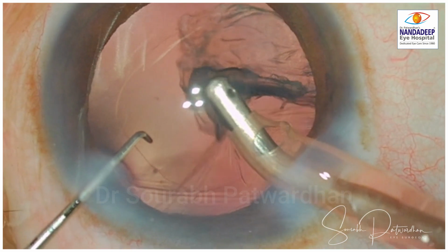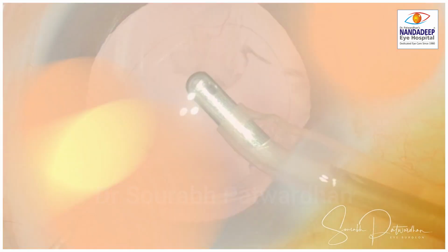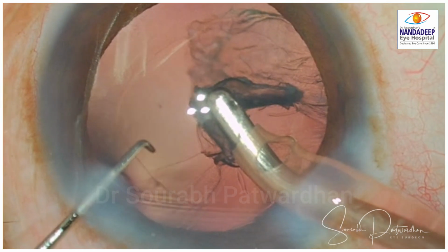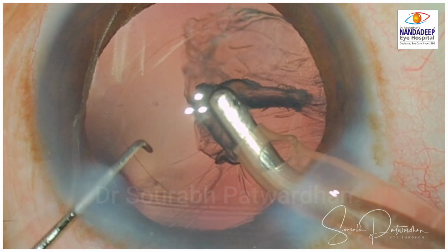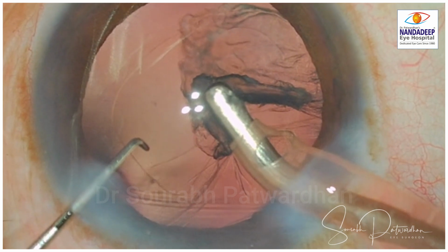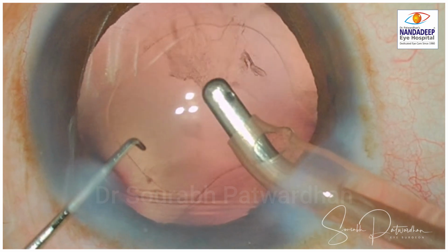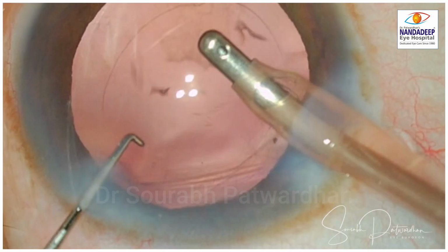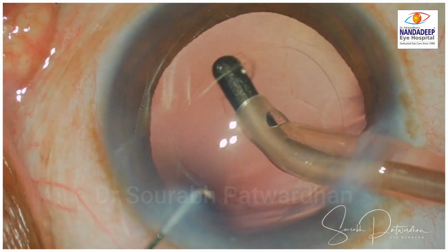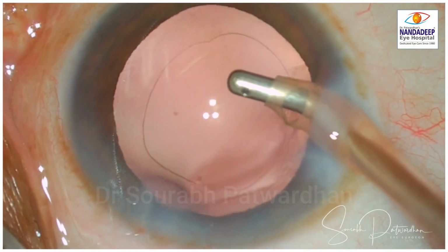So very carefully I release the cortex from the posterior capsule, and as I polish the posterior capsule you will find that there are wrinklings which are happening. So again I am going to show how the cortex was carefully released, and you can see the posterior capsular folds there, showing that in that area the zonular support is weak, and it's not a complete dialysis because you can see the anterior capsular rim there is still quite stable. As I polish the posterior capsule, you can see that the posterior capsule has become more redundant now.